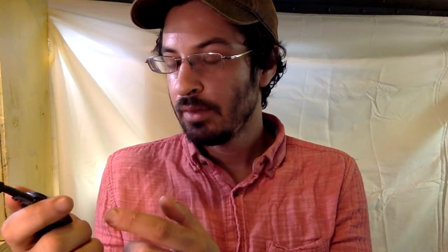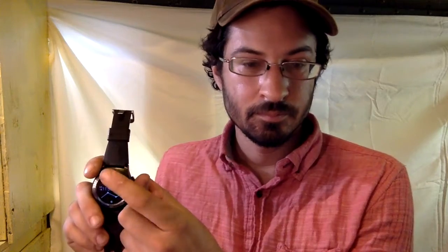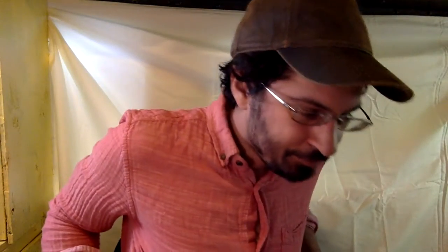And it's not perfect. I wish I could press this button and get straight into entering the carbs that I'm eating. Right now I've got to double click the top, and then I've got to scroll down to Wizard. That's not that bad, but I wish there was a way to jump straight to Wizard. But I mainly use my watch to be able to constantly monitor myself.